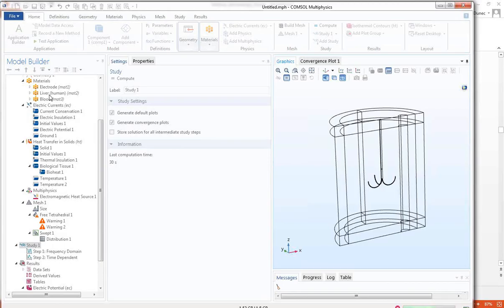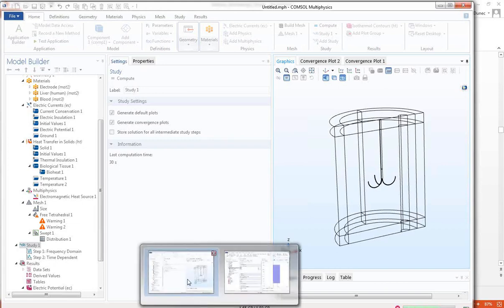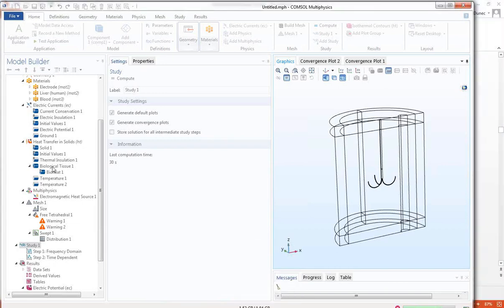Now, we are right at 11:45, so I'm not actually going to run this, as my time is on Pacific time. What I'm going to do is show you where you would add the tissue necrosis. It's pretty simple. I'm just waiting for this green bar to make it across, but I'll tell you what I'm about to do. I'm going to go into the biological tissue, and there's going to be a section in there to calculate the damage integral.